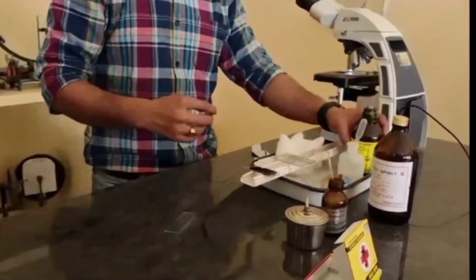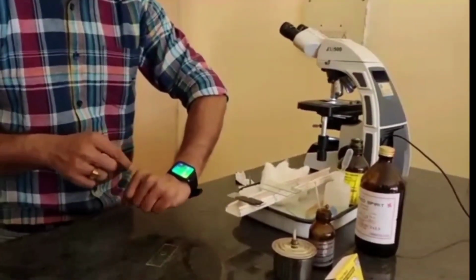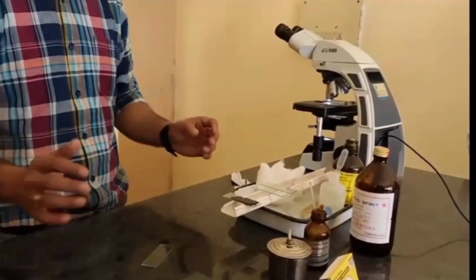So we have to count how many drops you need to cover all the blood film you have prepared.